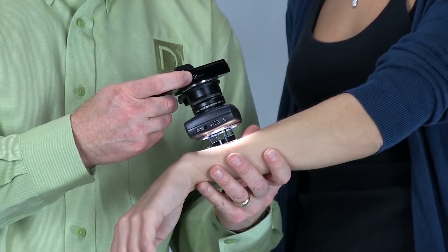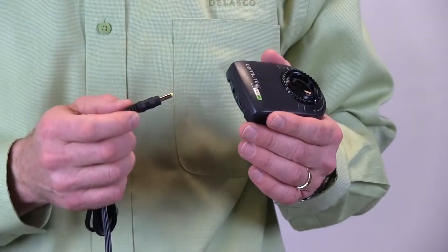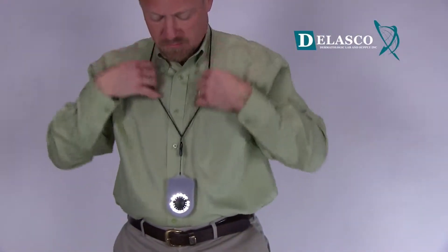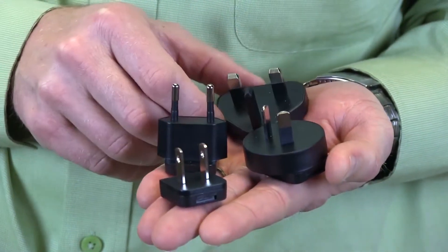The DermLight 2 Pro HR is threaded to attach directly to your digital camera, so taking photos has never been easier. The second generation DermLight continues to be highly transportable and features a rechargeable battery. The unit comes with a silicone sleeve and lanyard, a five-year manufacturer's warranty, and a battery charger including three receptacles for international use.